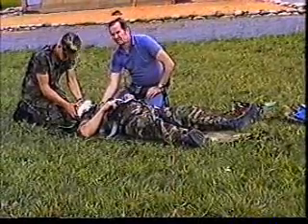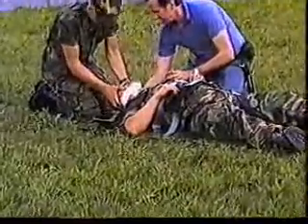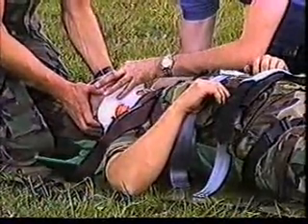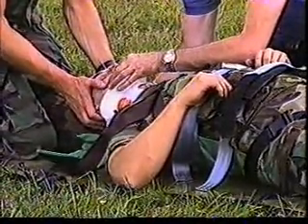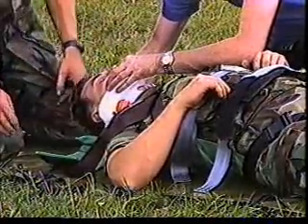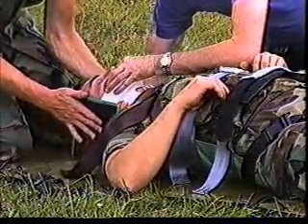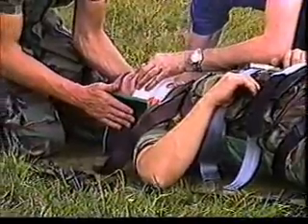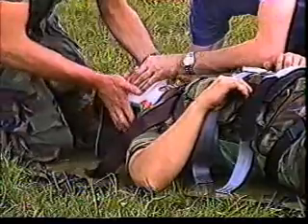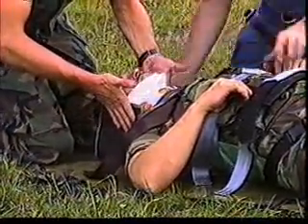Okay, I've already got this pad back here so he doesn't have to support the weight of the head, he just keeps it still. But I can put my hand here behind the head and reach up here with this hand, brace my wrist or forearm against his chest, and I got a good grip here below the zygoma. Now you can let go, take the head flaps on this device, pull them up securely, get them all the way up there. Now hold them there, but I want you to move your hand downward so I can secure the forehead strap above your hand. Okay? You got it? Okay, you're fine. He's not going to move. You don't have to hold too much.